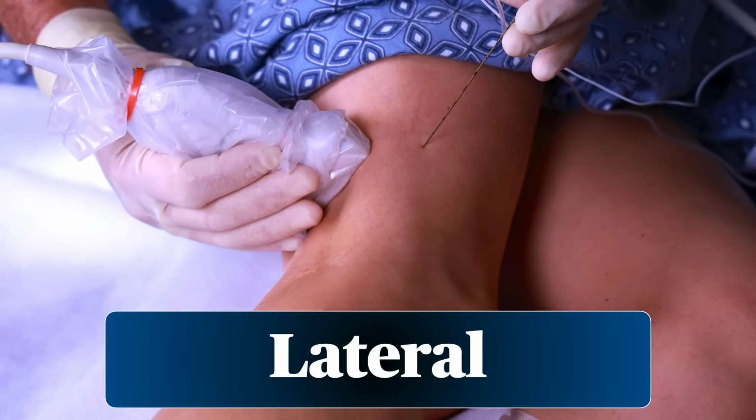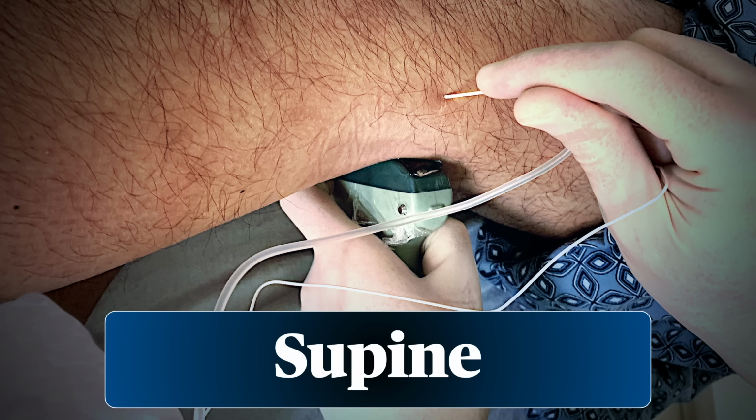Now, there are two kinds of people in this world, those that stand behind the patient and push with the probe, and those that stand in front of the patient and pull. Despite some vigorous debate between pushers and pullers, it's strictly personal preference. In trauma patients who can't roll on their side, we'll do this supine with the calf and ankle elevated on some blankets, just enough to get the probe underneath the popliteal fossa. Note that your image will look identical to the lateral approach.